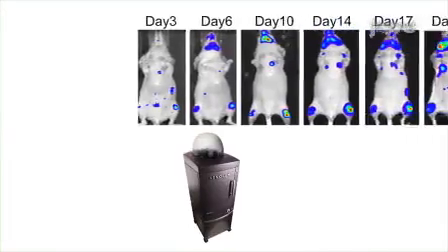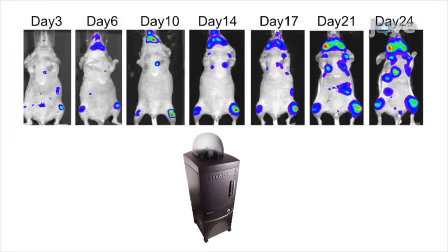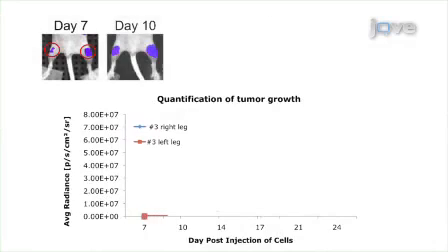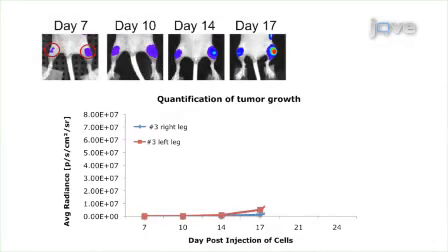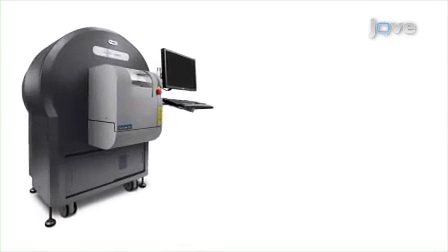Longitudinal imaging is used in preclinical studies to follow the progress of a disease or measure the effect of a therapeutic. In oncology, optical imaging methods provide rigorous tools to monitor tumor growth and deliver precise quantitation of cell growth or gene expression at each time point in such a study. However, these optical techniques cannot directly account for changes in the underlying structure.